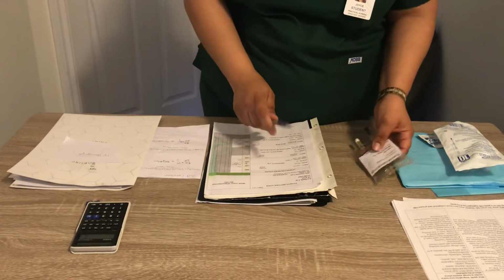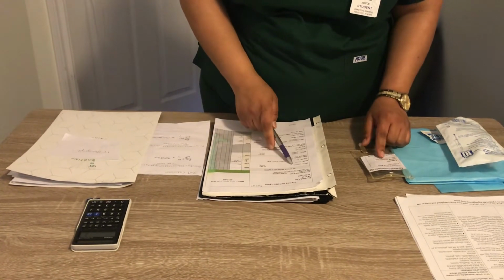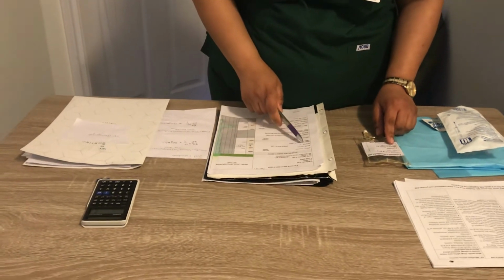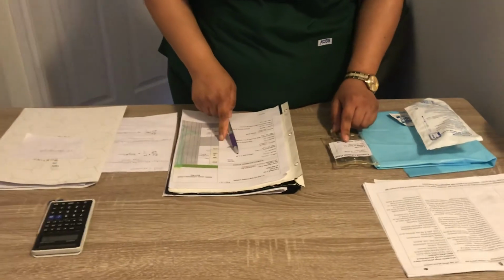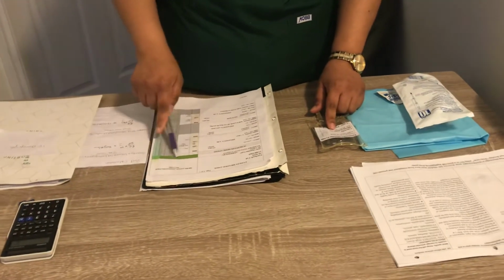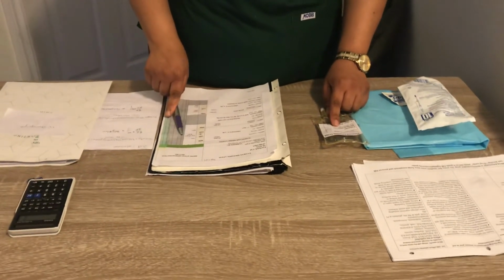Comparing the bag with the MAR. So I have Mr. Garland. Medication is cefazolin. The dose is 500 milligrams. The route is IV. The frequency is every 8 hours. I'm giving the 1400 medication. The site is going to be at the patient's right arm, and the reason is for post-op surgery.